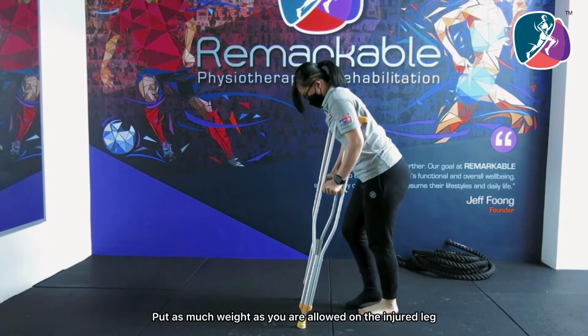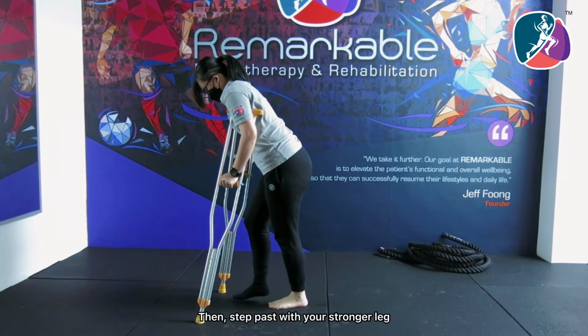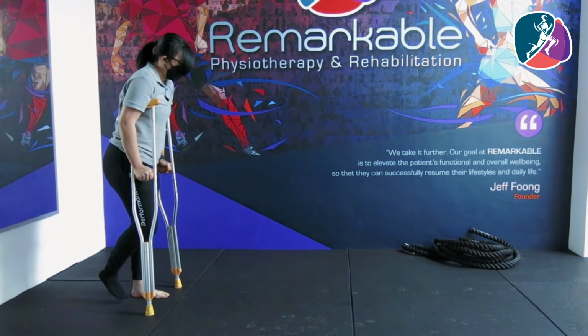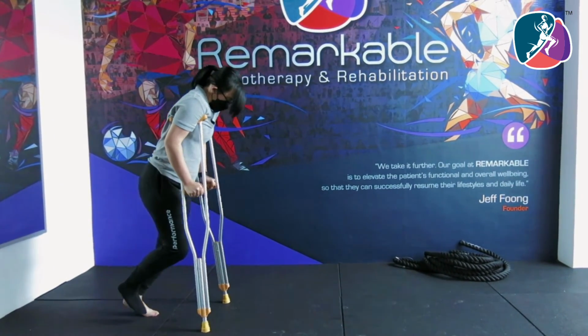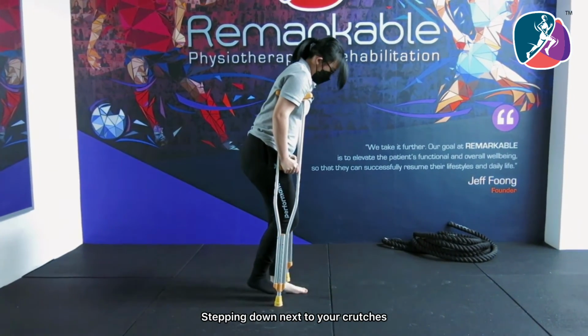Put as much weight as you are allowed on the injured leg, taking the rest of the weight through your arms and hands. Then, step past with your stronger leg. Now, to walk without weight bearing. Place your crutches in front of you and sway forward with your hips. Swing your good leg forward between the crutches, stepping down next to your crutches.